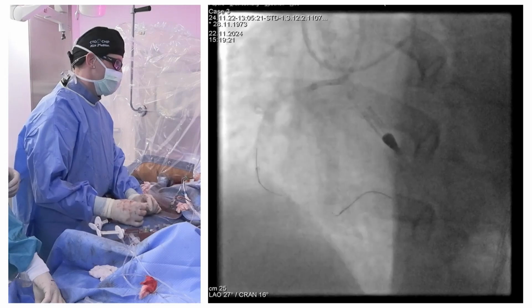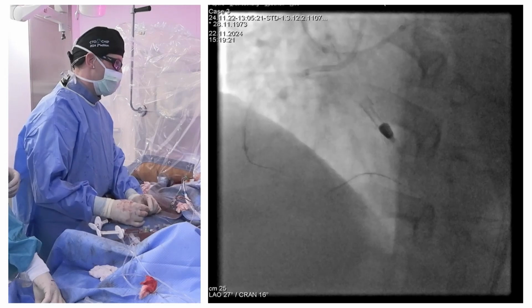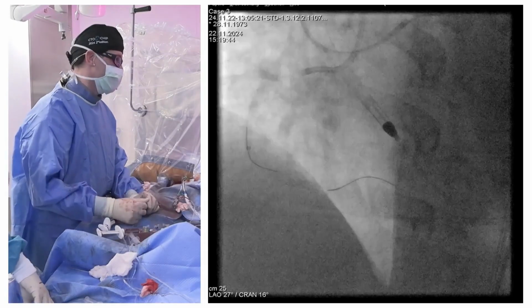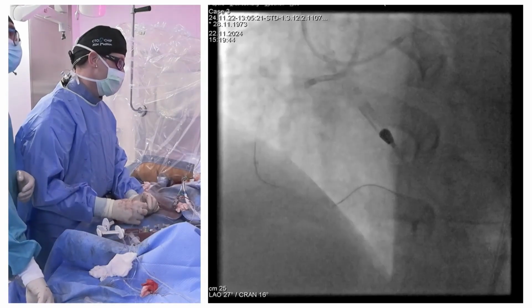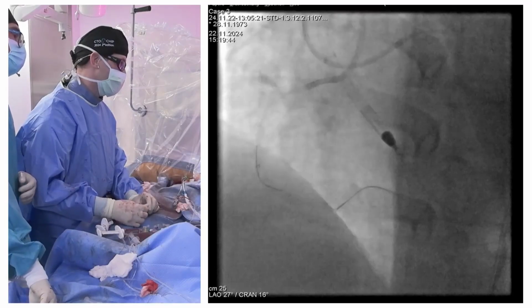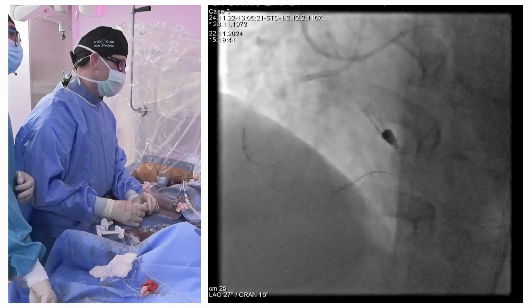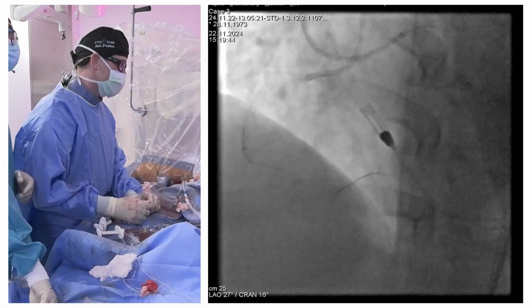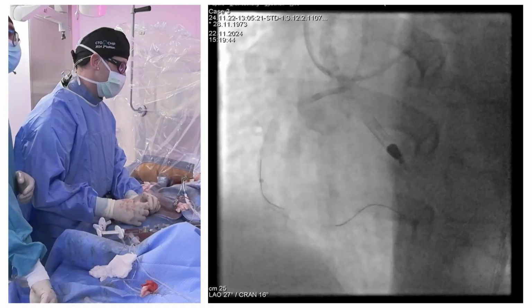And it might well be that the stent is a little bit underexpanded there. That might be the reason why. I would assume so. I think this is the mode of failure here in this case. And again, it's really, really tough to advance some wires through the stents here from both directions. So eventually we're going to get there.